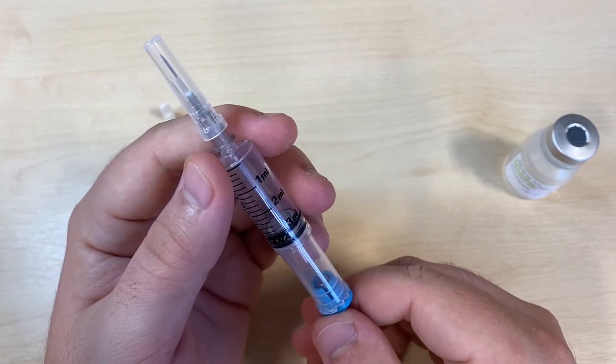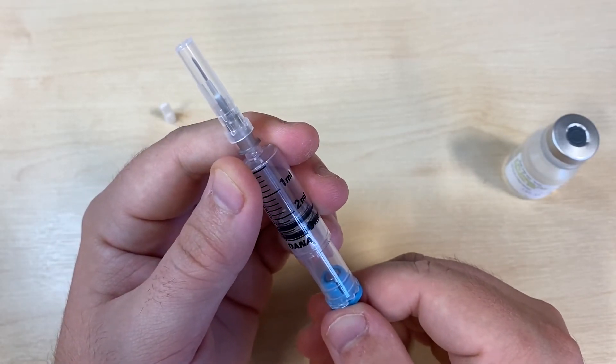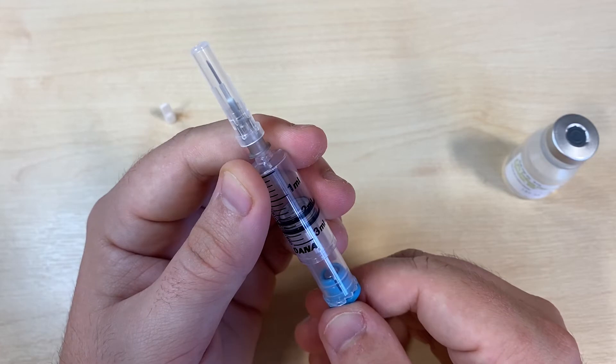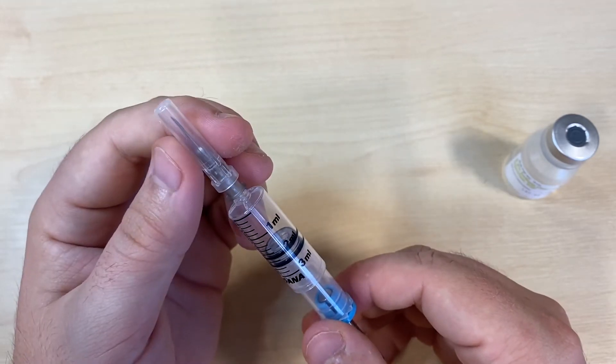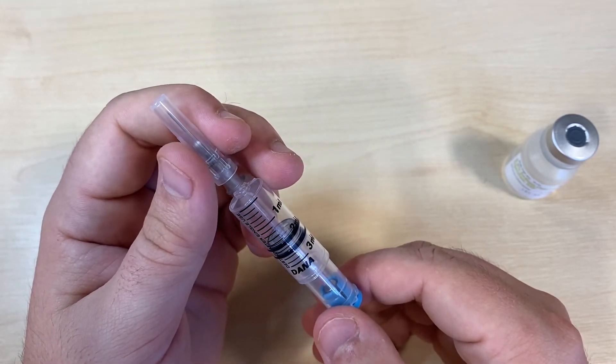Decide on how much insulin you'd like to fill, and set your plunger to that length. Each mill is 100 units, and each of the short markers is 20.